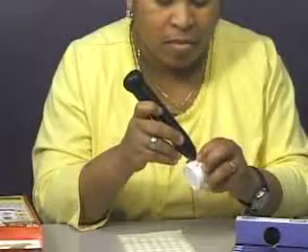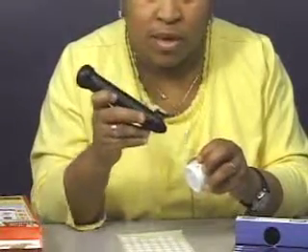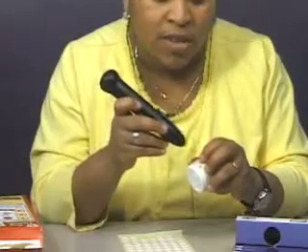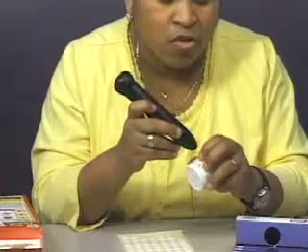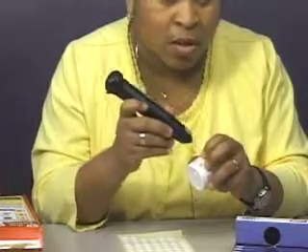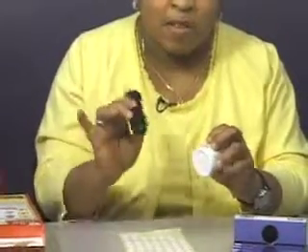Let's record a label. Advil Gel Caps. And now, the nice thing is all you need to do is touch the pen to the label without pressing anything. [Pen plays back:] Advil Gel Caps. It barely touched it, but there it is. So that's how you create a label.